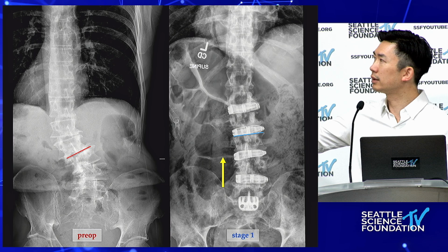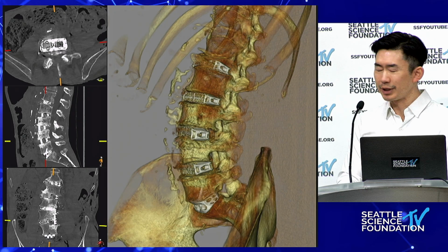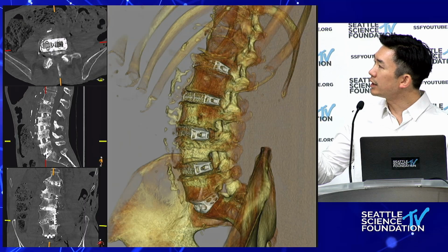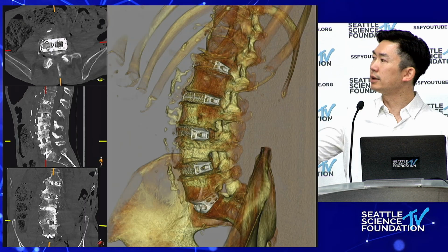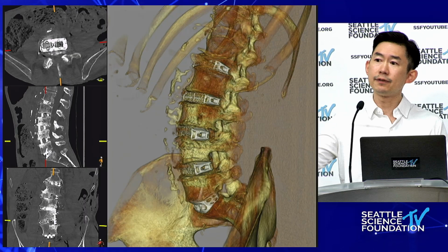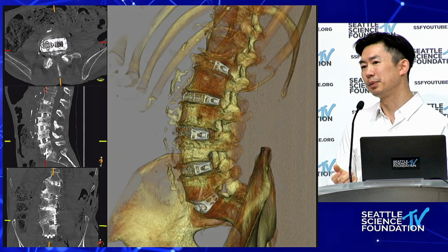And I think that's why the bones move. And I think that's why in this case the cages A to P are quite large, mostly because I'm inserting them at the front corner, and then they fit into the back. But that's the only thing I can think of that might be a little bit different.